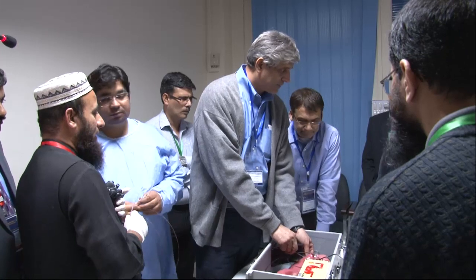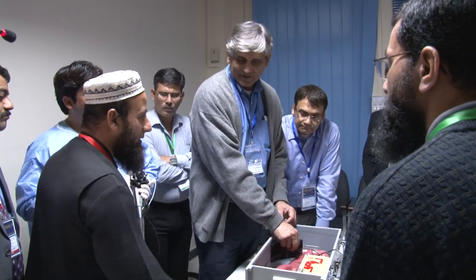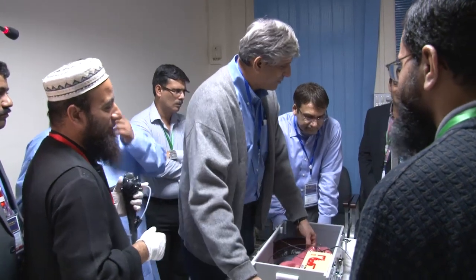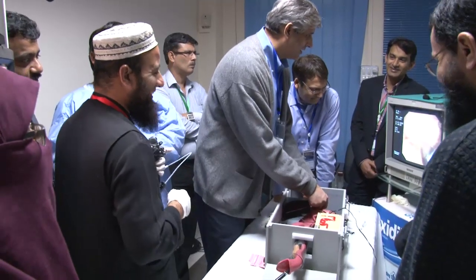Why don't introducing catheter pull करना? मैं कर रहा हूँ, आप बिल्कुल करीब ले. आप भी तो कुछ करें. सर वैसे तो मैं चाहूँगा कि करीब आ जाए. नहीं करीब मैं आपको कर देता हूँ, कोई मसला नहीं. करीब मैं कर दूँगा, लेकिन करीब का इशू नहीं है. कह रहे हैं आप.